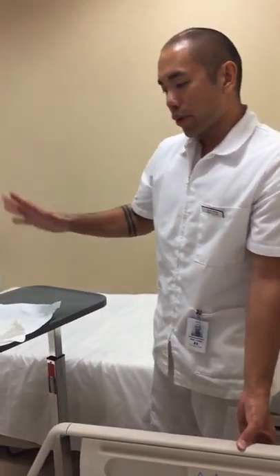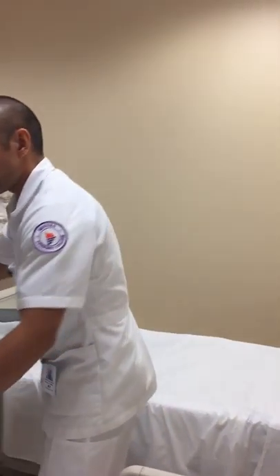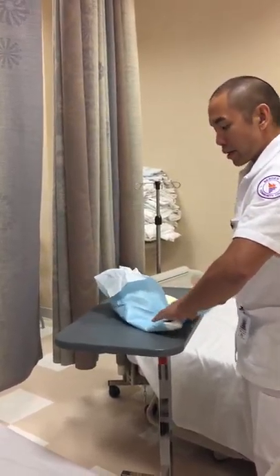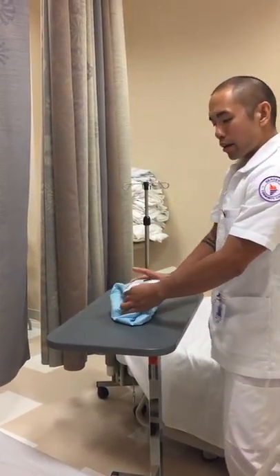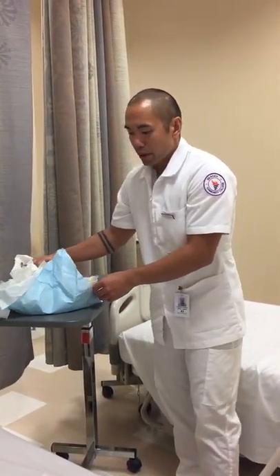Before I leave, I'm going to go ahead and gather my equipment and make sure I leave the room in the condition I entered it. I'll stow this away, leave the room, and wash my hands. Then I'm going to document — making sure I noted the insertion site of the central line, as well as any swelling, redness, color, and any crepitus around the section. And then I utilized sterile technique for the central line dressing change. And that is how you perform a central line dressing change.